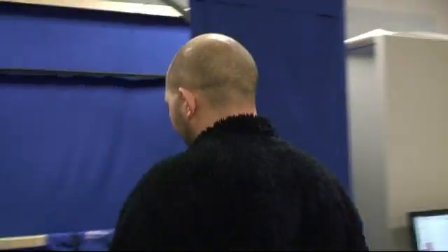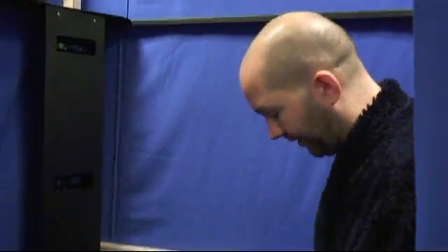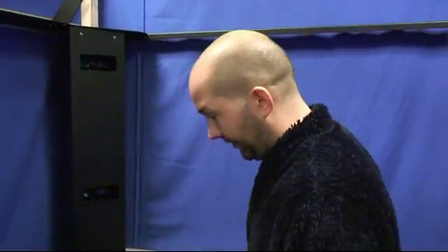For the scan, you'll step into the scanner booth and stand with your feet on the foot positions on the floor, with your arms out to the sides and looking straight ahead. Before entering, you'll remove your dressing gown and place it down in front of you in the scanner booth but away from the scanner head so it's not within the captured shot. Once you're in position, the technician will start the scan process on the computer, which will direct you through the steps of your scan being captured.